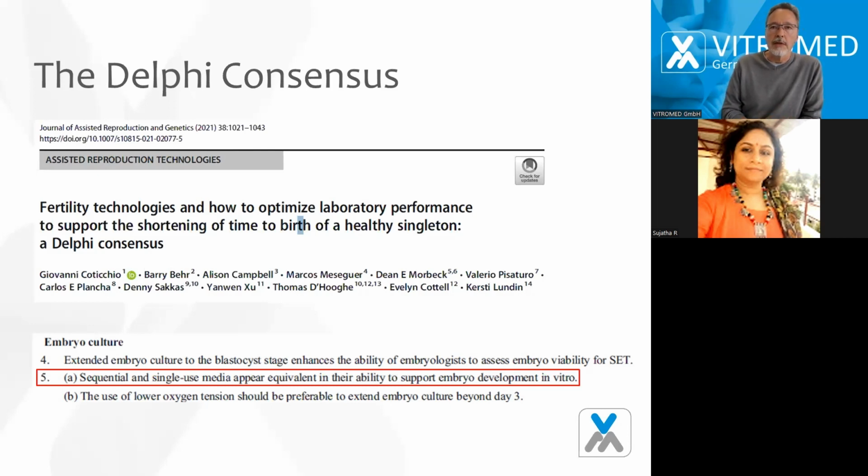And one point was the embryo culture, and they developed some statements, and they sent them to 17 other really experienced experts to do an assessment of what they think about these different things.